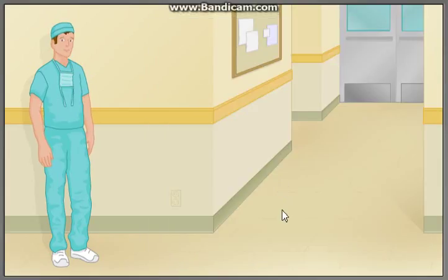We couldn't ask for a better participant. You've done an excellent job. Are you sure this is your first total knee replacement? Our patient will remain in the hospital for 3 days, followed by 3 to 8 weeks of physical therapy. Because of this surgery, our patient will have significantly reduced pain and increased mobility.